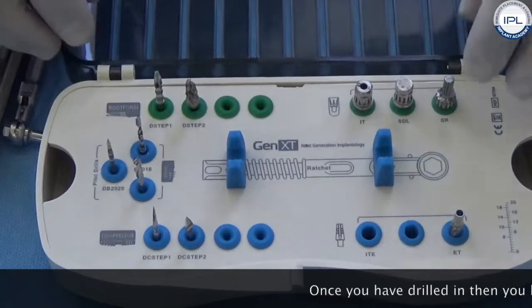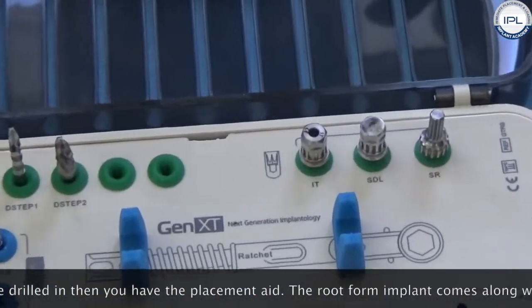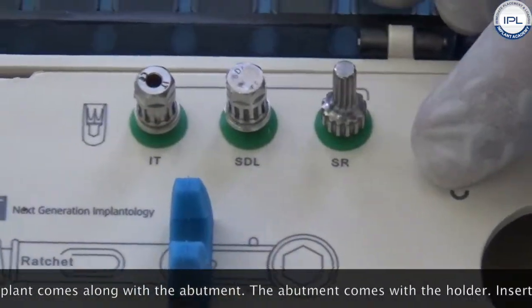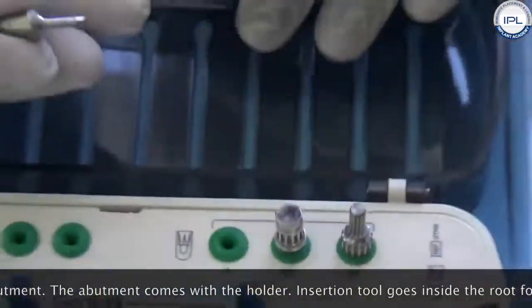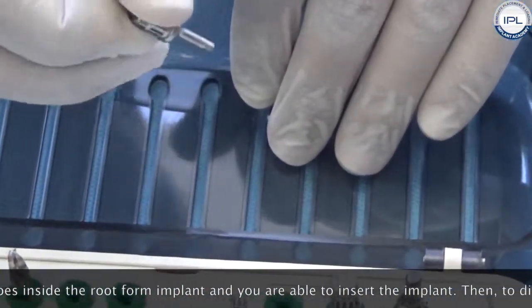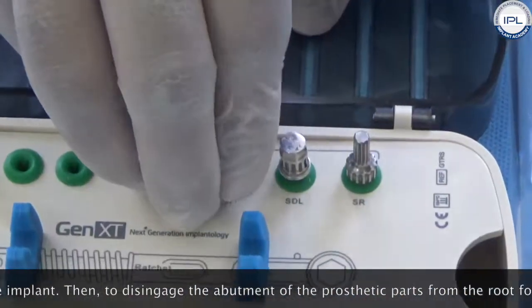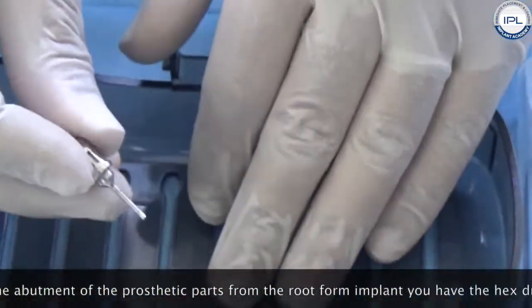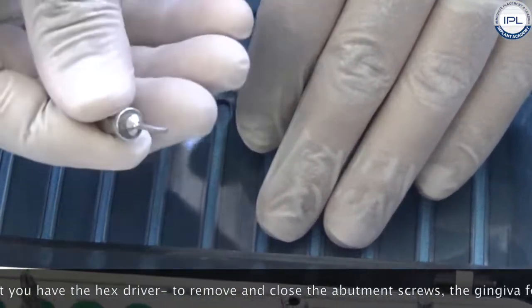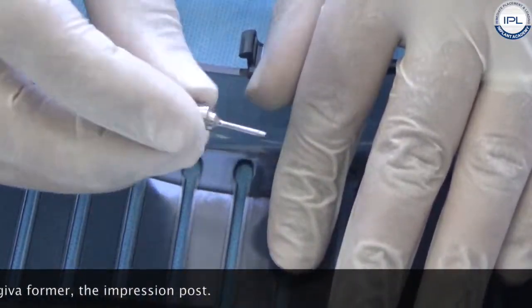Once you have drilled the site, you have the placement aid. The root form implant comes along with the abutment, and the abutment comes with its holder. This insertion tool goes inside the root form implant and allows you to insert it. The same rules apply. To disengage the abutment and all prosthetic parts from the root form implant, you use the hex driver, which removes and closes the abutment screws.